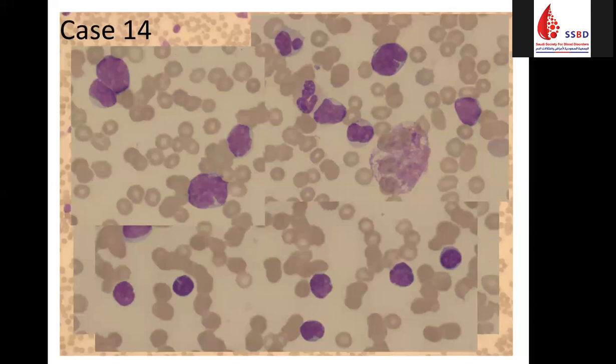The thing is that some cases will look like a CLL by morphology, where you will have only small mature-looking lymphocytes, and the flow cytometry is the diagnostic. But in this case, you shouldn't think that this is a case of CLL unless it's, for example, transforming or something else. Like in this case, it's not a classic CLL to start with. So mantle is a good differential.